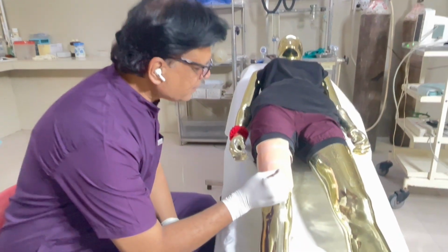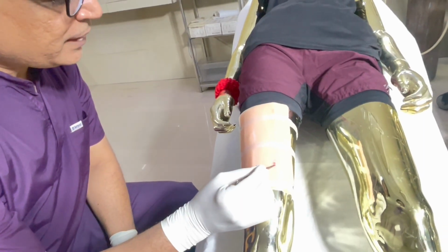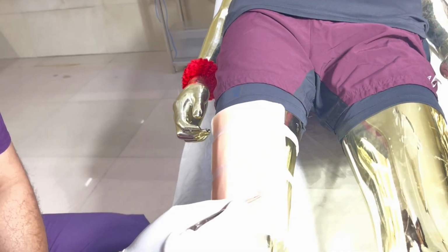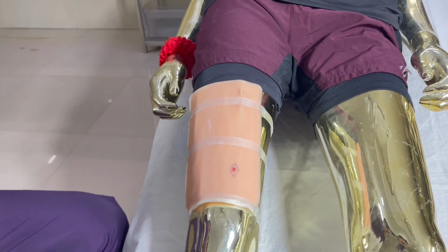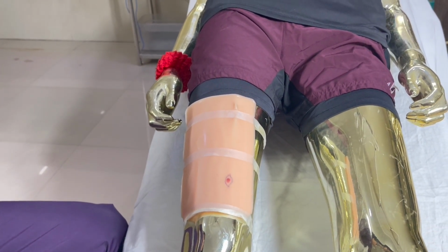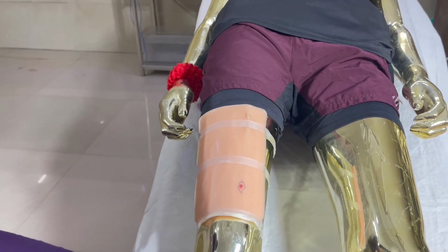Are you feeling the sensation here? Yes. Now are you feeling sensation now? So it means this part is numb now. I will take a blade, number 11 or number 21 blade, and apply.